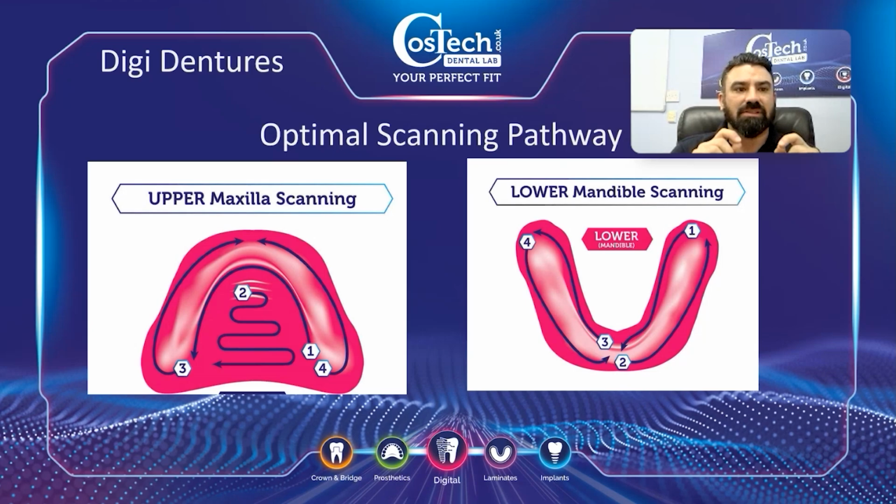You can take the ridges. You then go over and back, taking the buccal surfaces. Pretty similar when you're working on the mandible. The flip over point, you can see it's going from point 1 to point 2. That flip over point is because it's making sure of what's called stitching. It's where it's taking one plane and another and knowing where to match it.